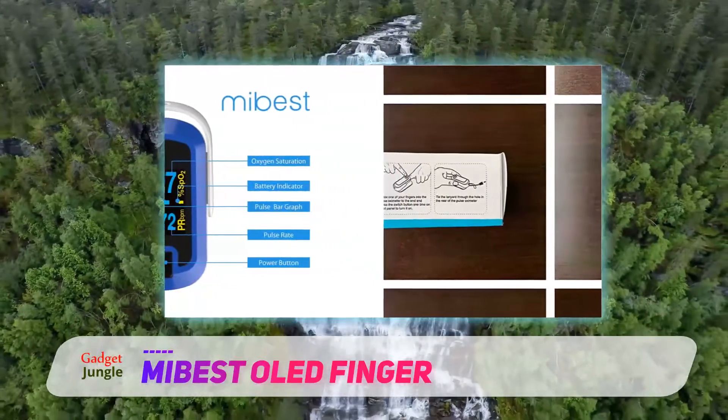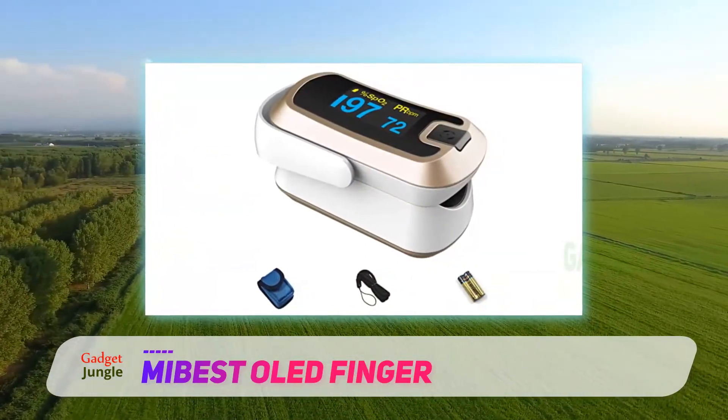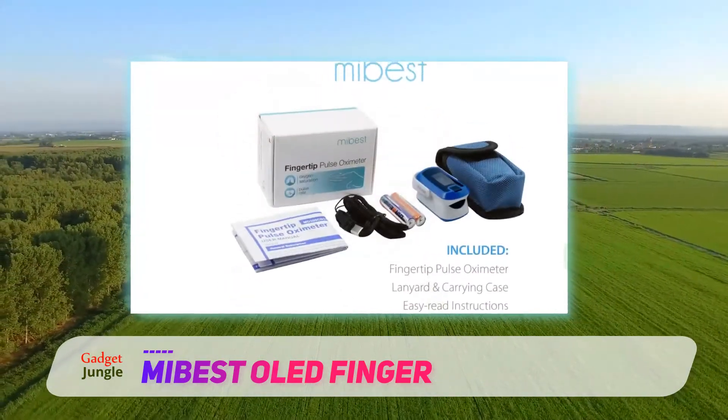Bundled within the box are an instruction manual, an adjustable and detachable neck lanyard, a carrying case, and a pair of AAA batteries. It's portable and ready out of the box. The slim design also allows you to put this device in your pocket without much trouble.